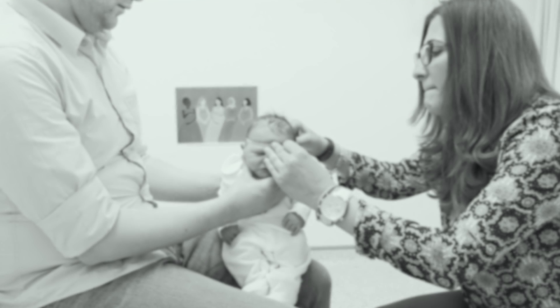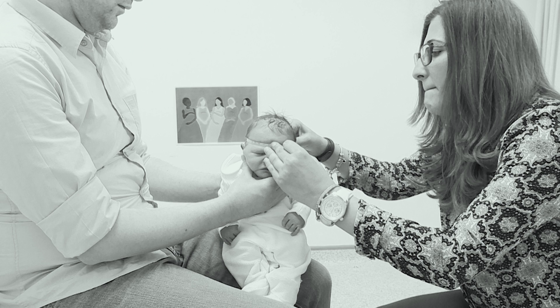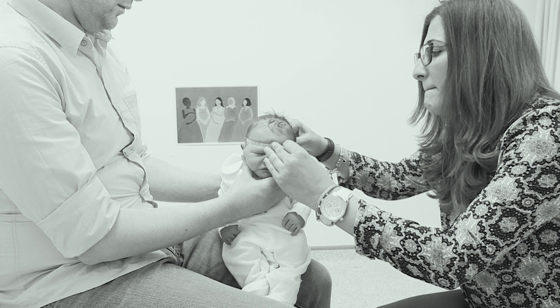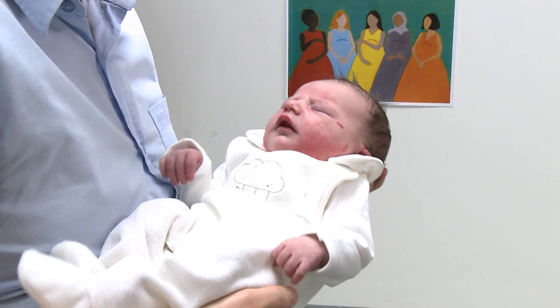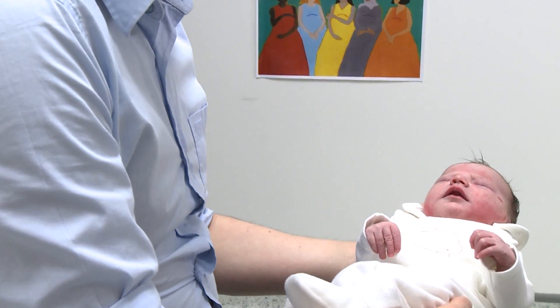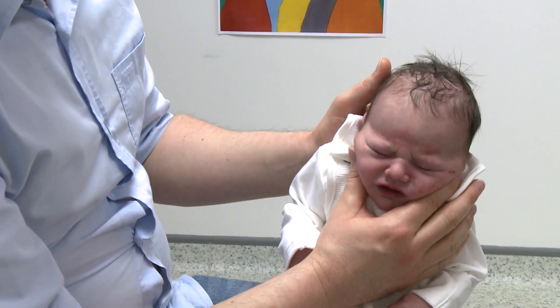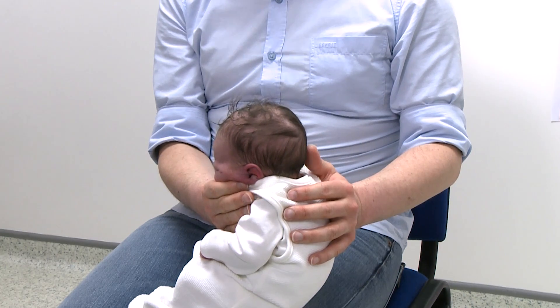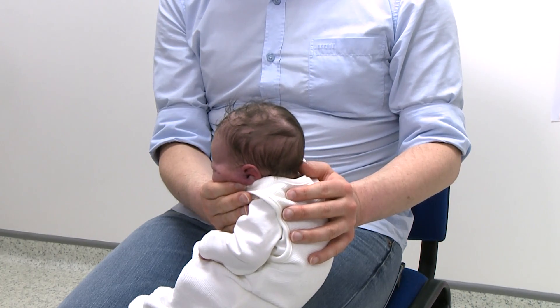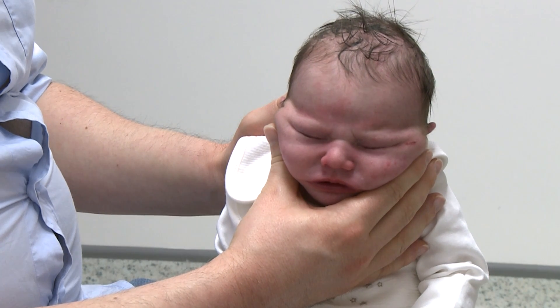You will need two people to take these measurements: one to take the measurements and one who can be the caregiver to act as an assistant. The baby should be held in a sitting position on the caregiver or helper's lap, similar to the position for winding a baby, with gentle but firm support at the back of the neck and under the chin to stop the baby's head from rolling.